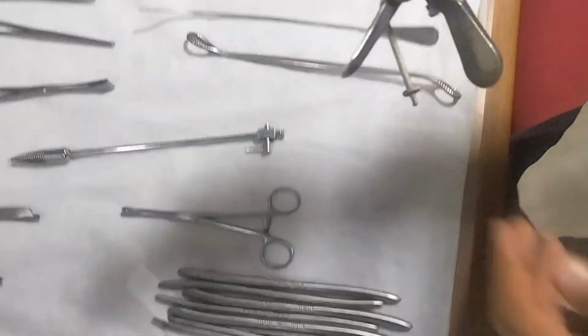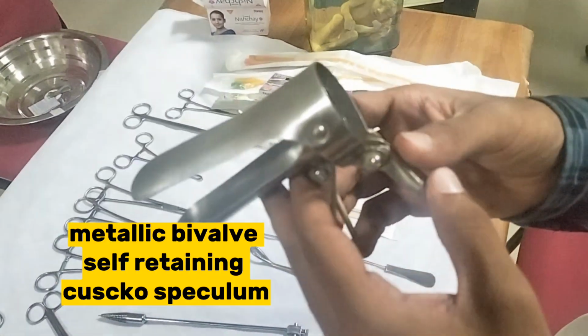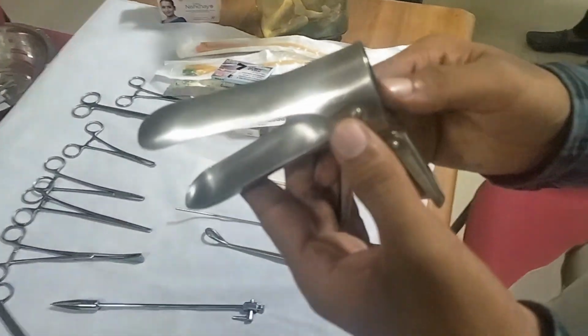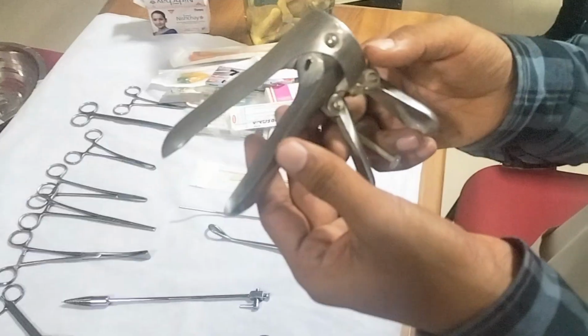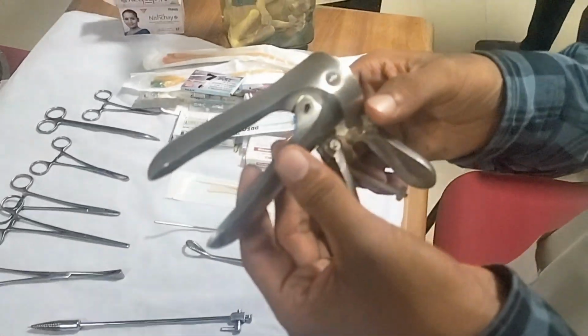Next. Here we got metallic bivalve self-retaining Cusco's speculum used to hold anterior and posterior vaginal wall, used for insertions of intrauterine contraceptive device and intrauterine inseminations, or to inspect cervix or uterus or in injury, bleeding or discharge or leak.